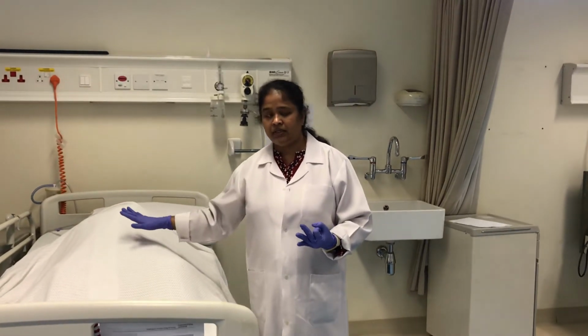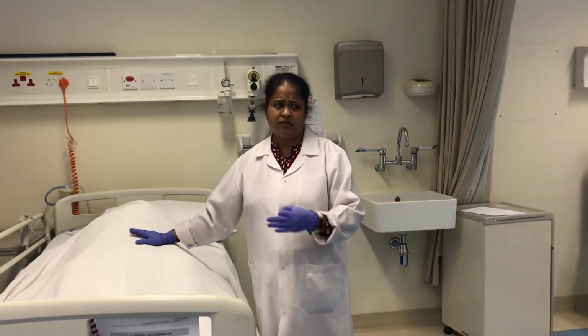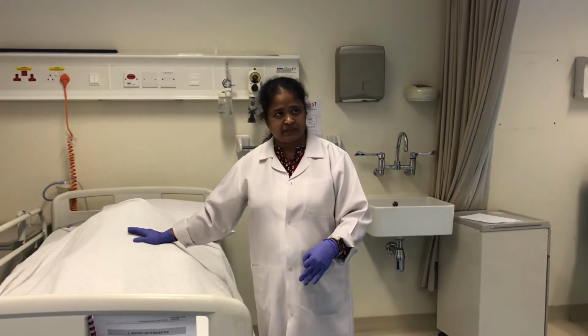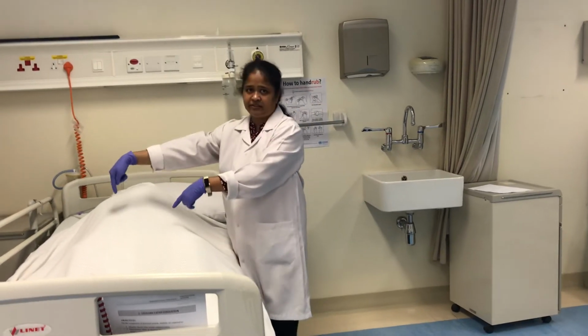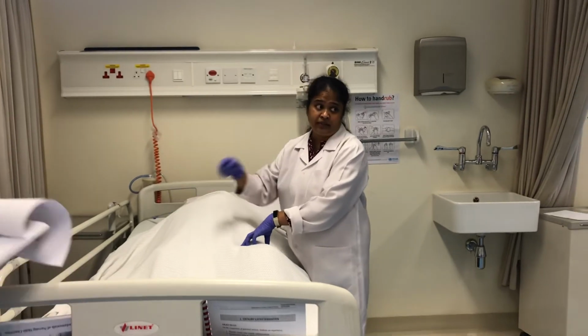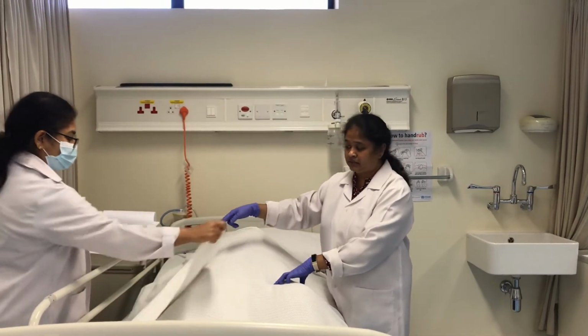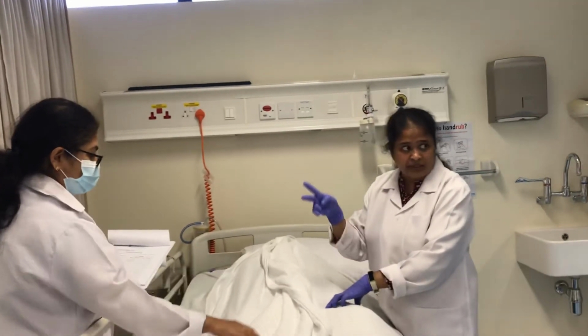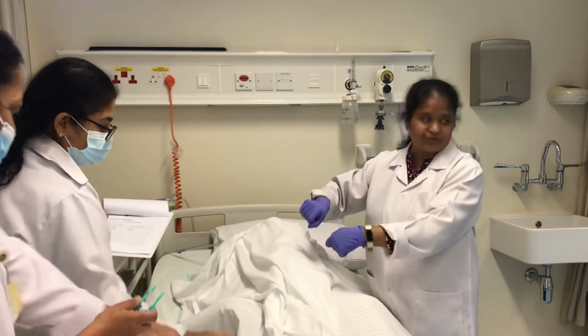Okay, now they have been on this maybe today 2 days over. They want us to collect a urine specimen. How do we collect it? We have to clamp it for some time, then disconnect at the edge. We should not take urine from the bag, it is wrong. Even for checking sugar, we should not collect it from the bag. We should take it directly from the tube only.